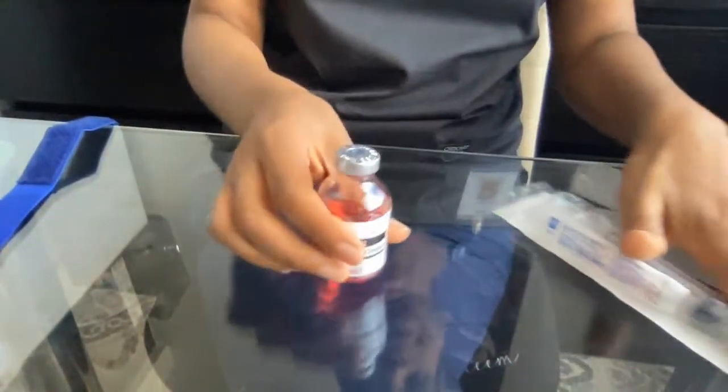Hi, my name is Mahalet, and I will be doing a video to show you how to administer an injection subcutaneously. First thing I would do is gather my materials, which I have here.